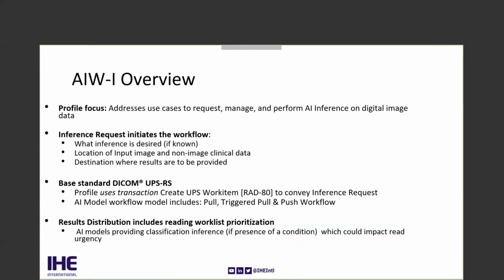So that's what drove us to come up with this profile, focusing on the use cases to request, manage, and perform AI inference on the digital images. Very basic fundamental request: what kind of inference is desired? Maybe all you have is, hey, I've got this CT study, I want you to look at it. Maybe you can do it, maybe you won't. But keep it very broad, or very specific.